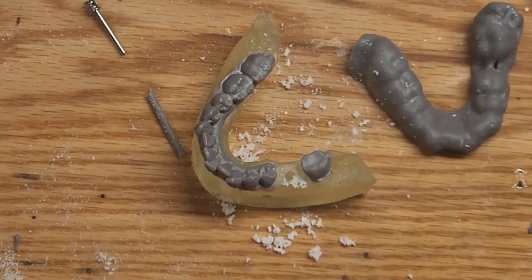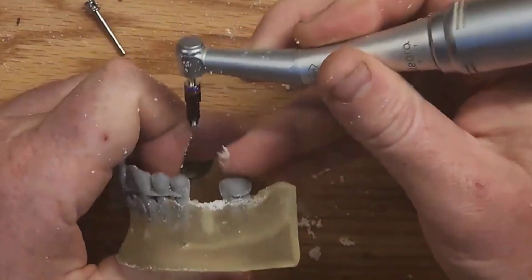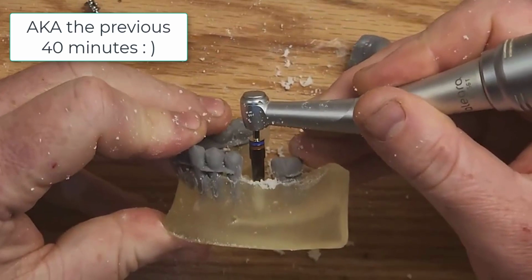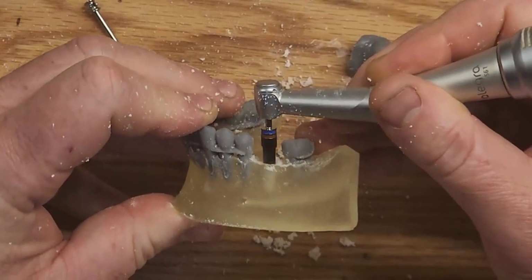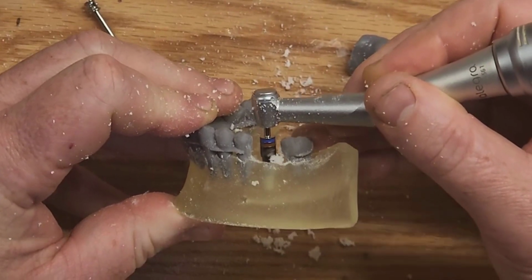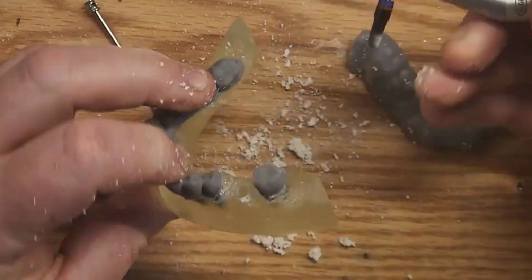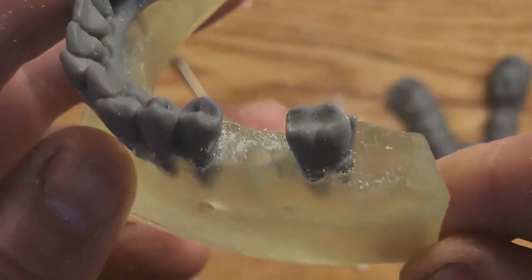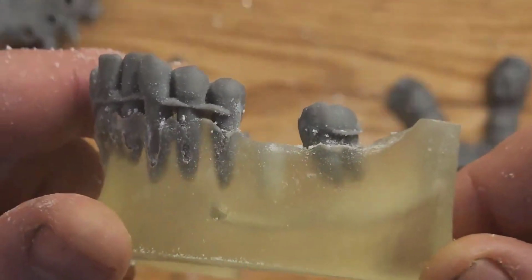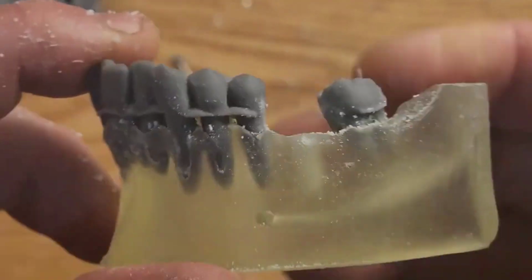So I can get you the name of this resin, and if you guys want, I could make you a tutorial video showing how I make the teeth so that I can insert them. But this is a really good demo model. Now this is not a real implant motor, so it doesn't have the most torque. This is just a lab motor that I stuck an E-burr into. But you can see that is as good a simulation as you're going to get. Now granted, it wasn't guided, but it would be the exact same process if it were.